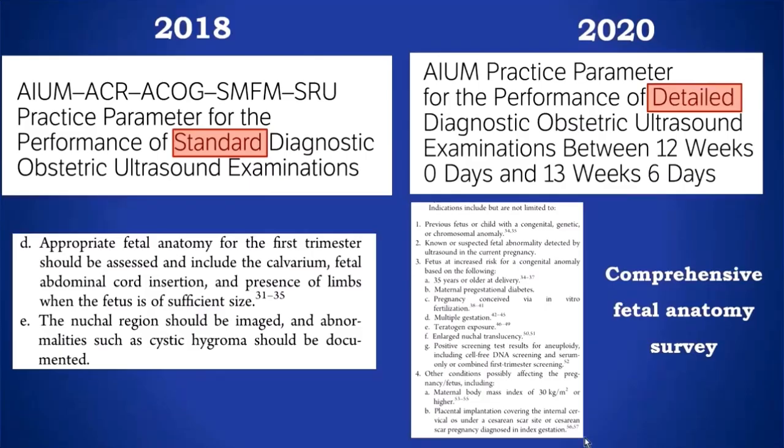So this is really a lot of patients will fall into one of those categories. And what's really new, just hot off the press: in the past, many practices were hesitant to utilize those parameters and push forward because, despite the fact that we had them, we were not able to bill for those services. But now we have a dramatic change in this situation, and now the code 76811 can be billed twice, in the first trimester for this detailed ultrasound, and then in the second trimester.